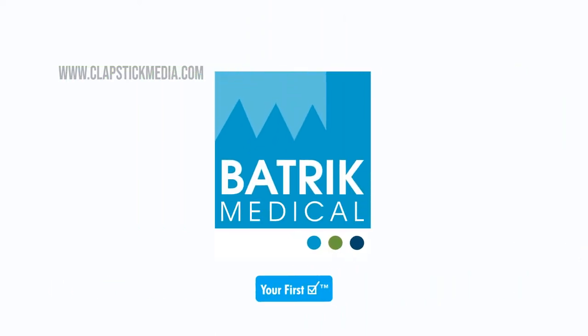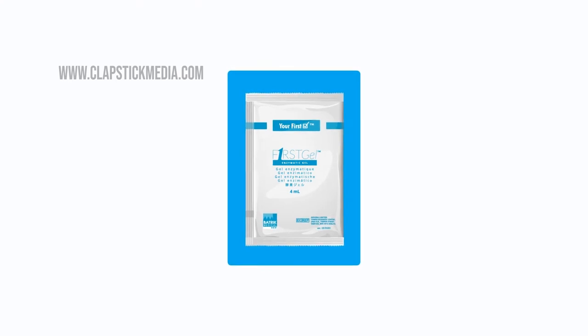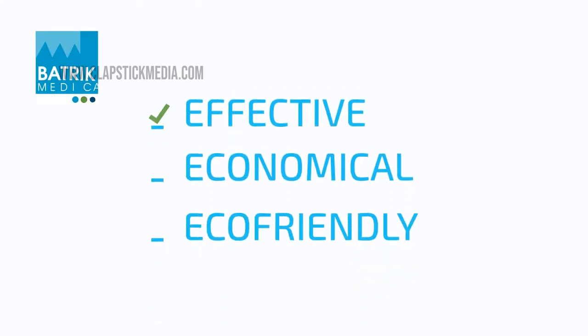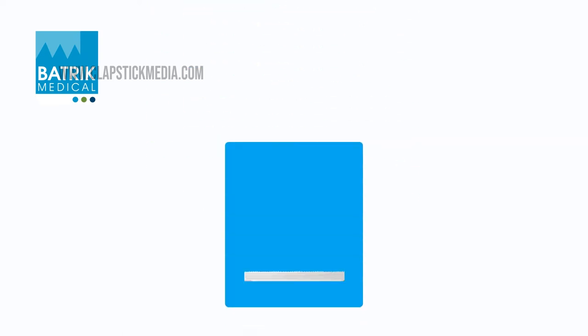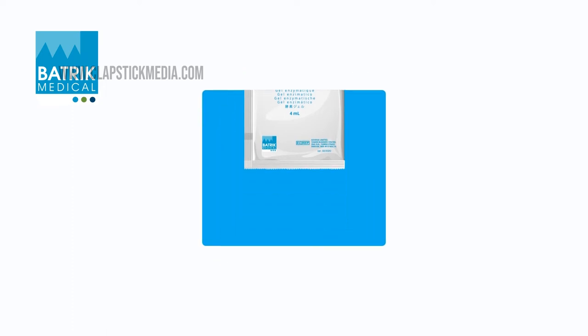Batrick Medical brings you ViroSachet, a unique triple enzyme cleaning solution. A simple yet effective system which is highly economical and eco-friendly, consisting of a kit that includes a four milliliter sachet of triple enzyme gel, a flat sponge, and a stainless steel bowl.